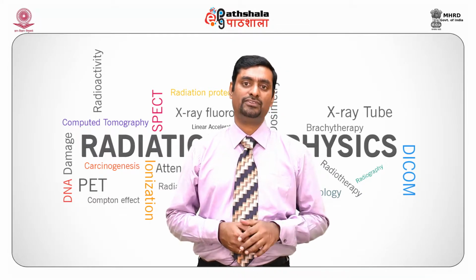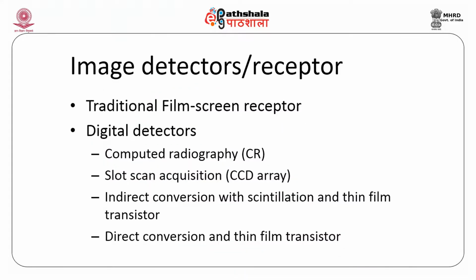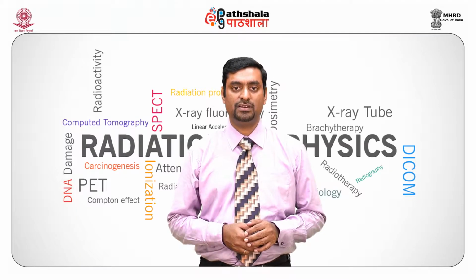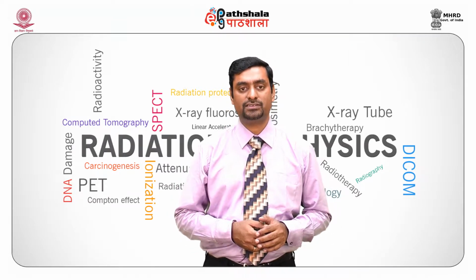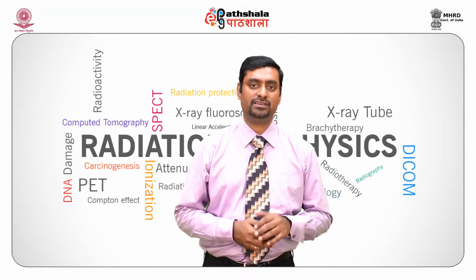There are various types of digital detectors that can be used in mammography. The various detectors are computed radiography, slot scan acquisition CCD array based device, indirect conversion with scintillation and a thin film transistor, direct conversion and a thin film transistor. These are various digital detectors. Let us move on slowly towards film screen receptor.